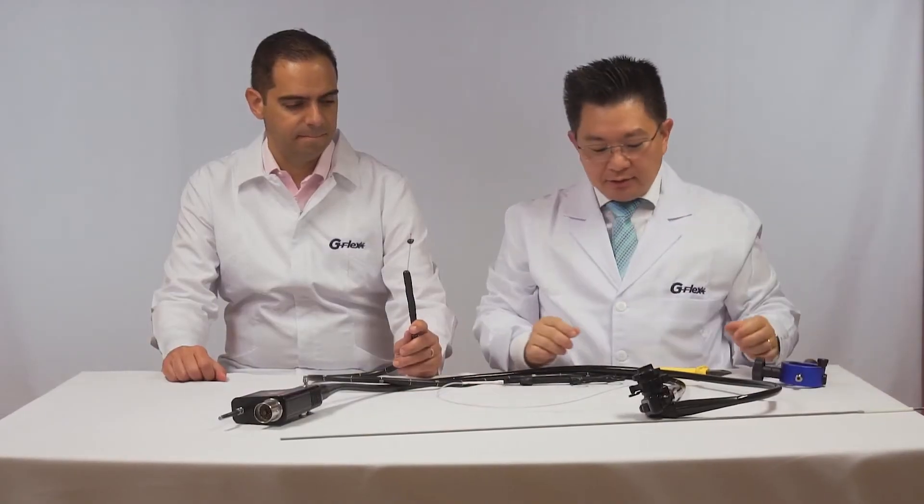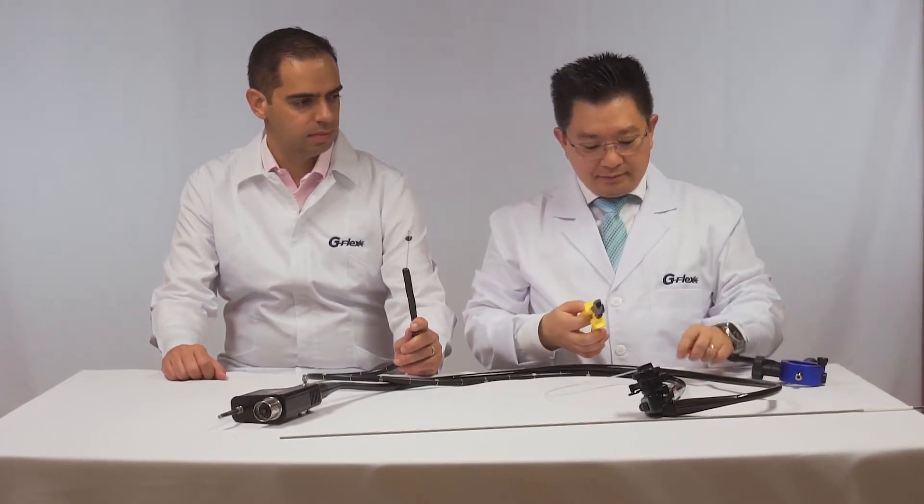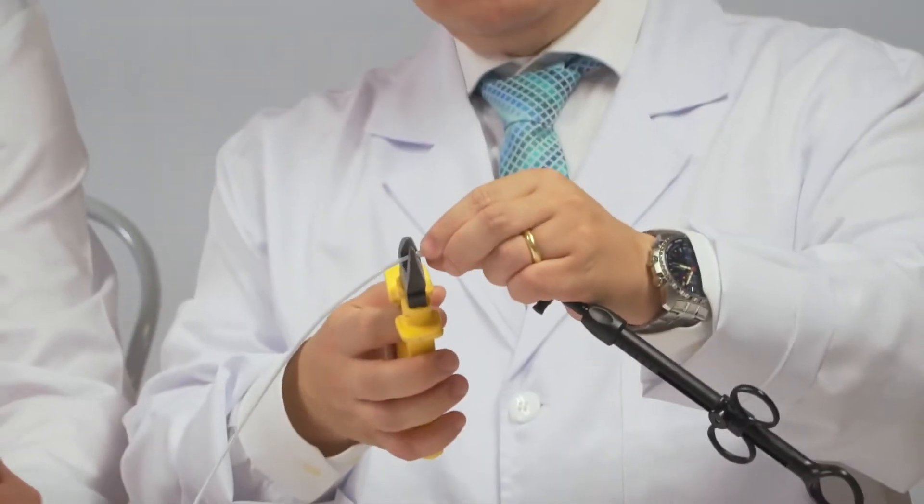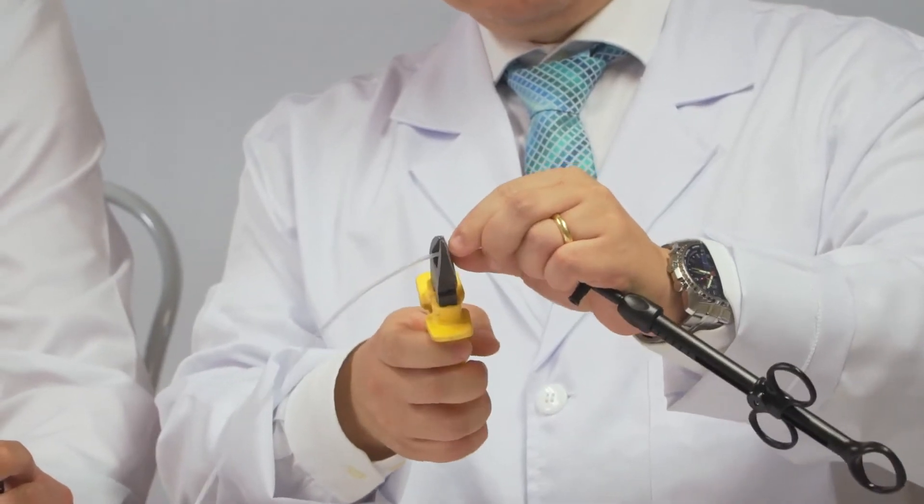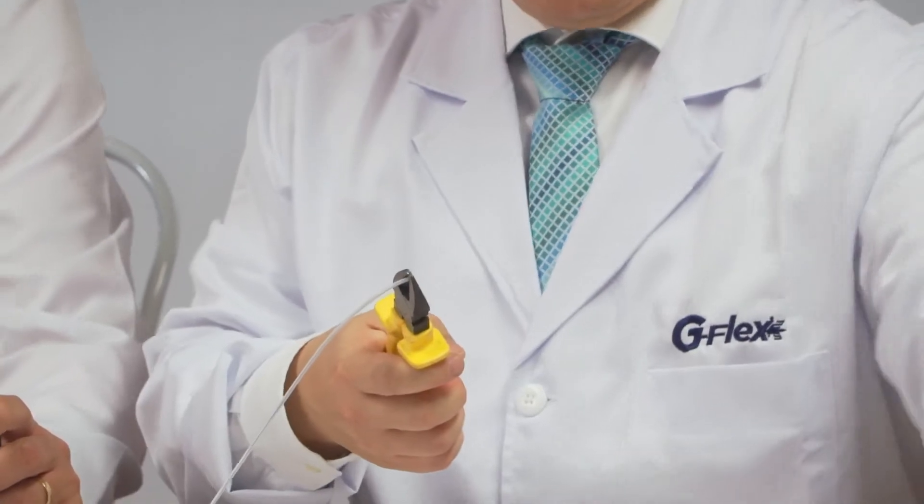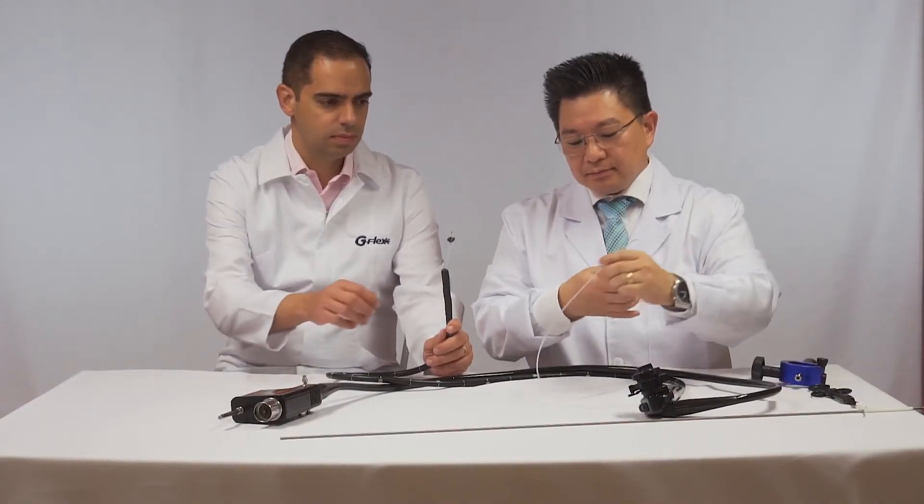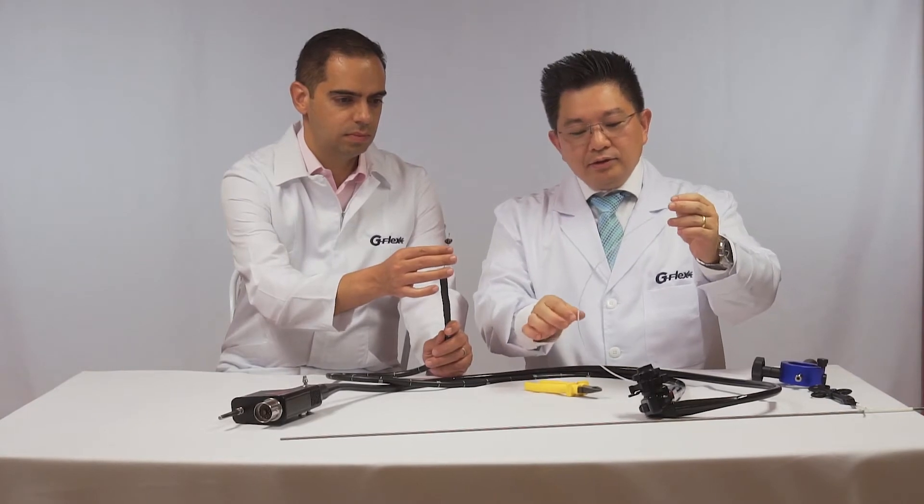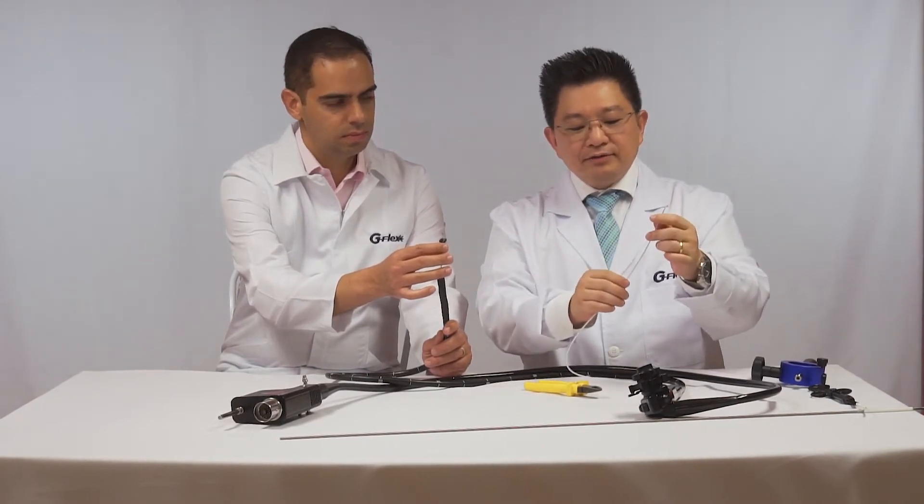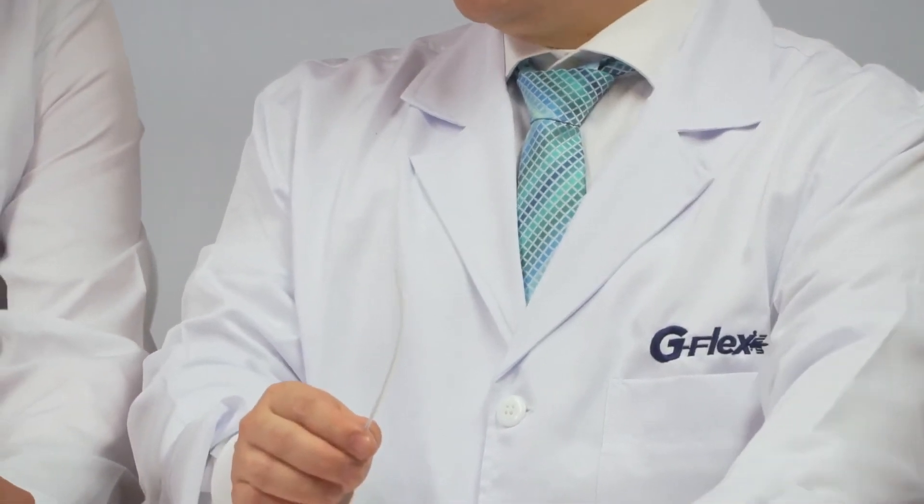That's why we need to cut the device like this. Cut off the handle and now you need to keep the plastic sheath to prevent damage to the working channel of the duodenoscope.